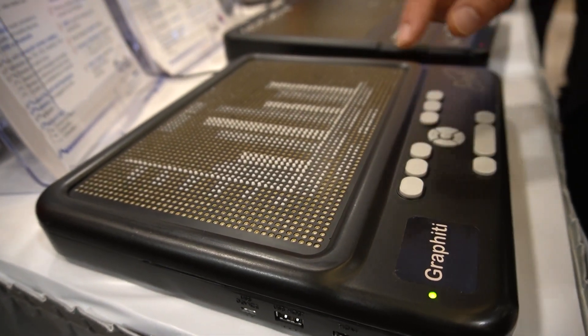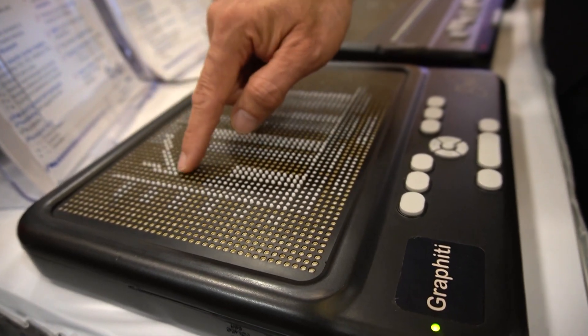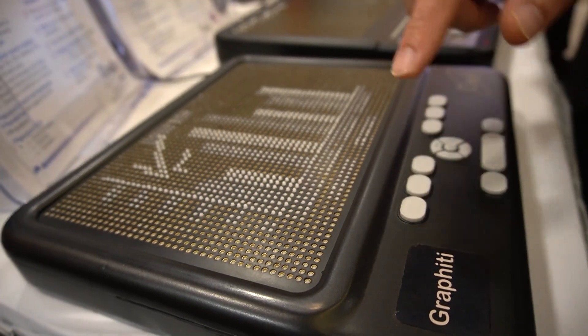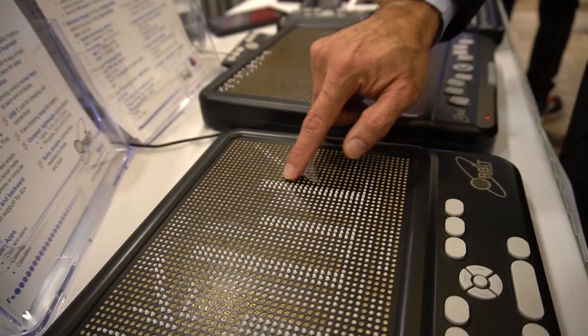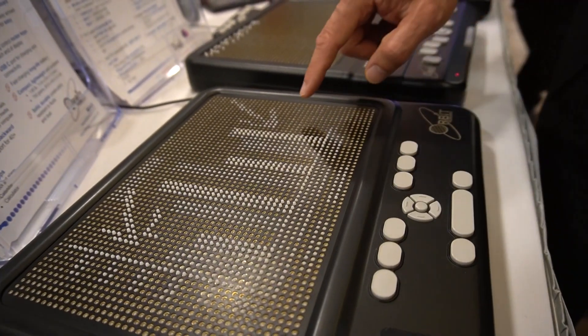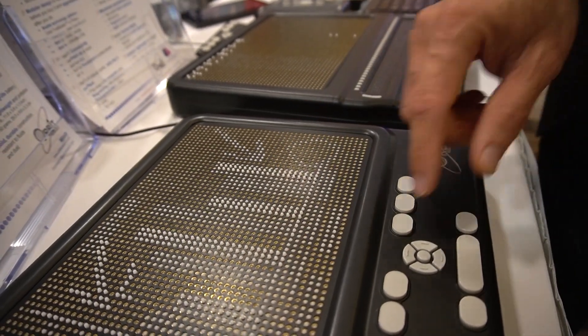Now if I wanted to annotate or edit it, I can draw on this by simply pressing a key combination. Here I'm showing something with an arrow. I can draw at different heights — I'll draw at a lower height now, draw another arrow here, or draw at yet another height and show a circle here. These pictures can then be saved.